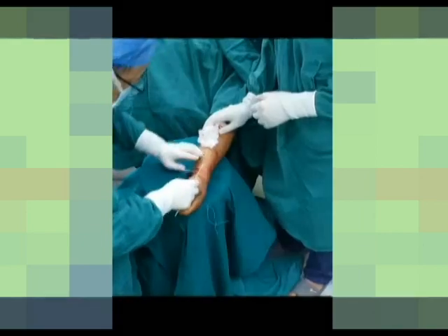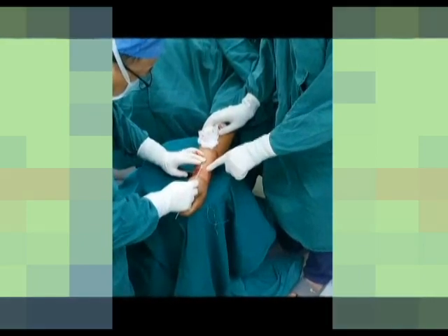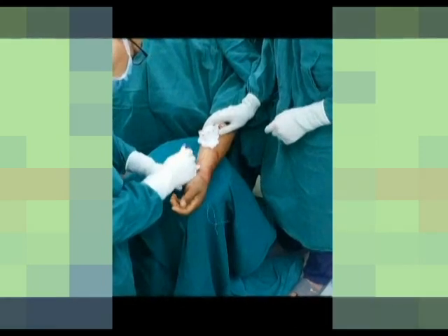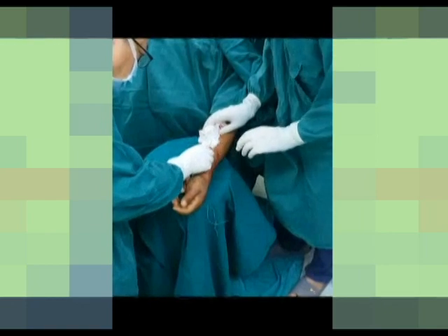If there is difficulty in reducing residual radial translation, we can reduce it using a joystick technique by inserting a second K-wire from the radial side of the radius. Alternatively, significant radial translation can be corrected by inserting a second K-wire over the ulnar side of the radius.